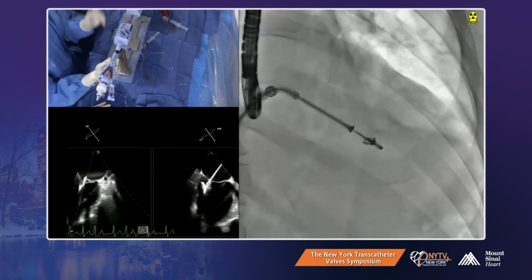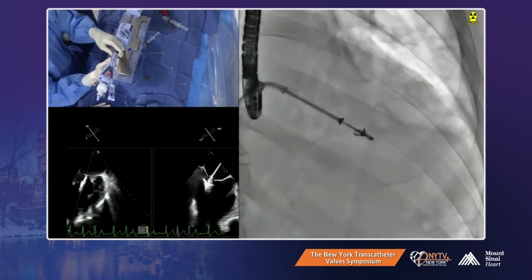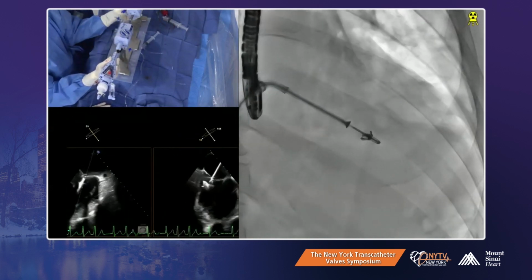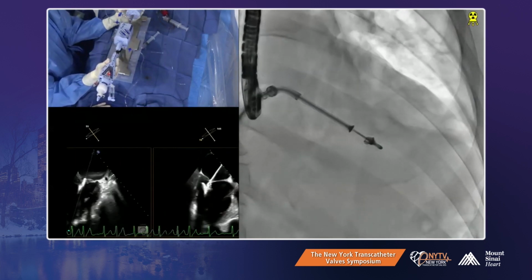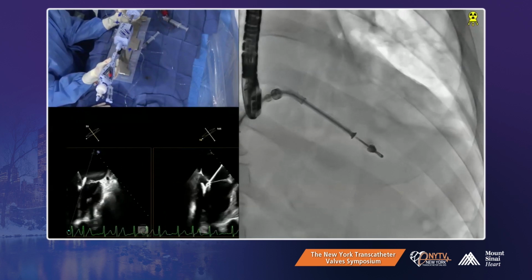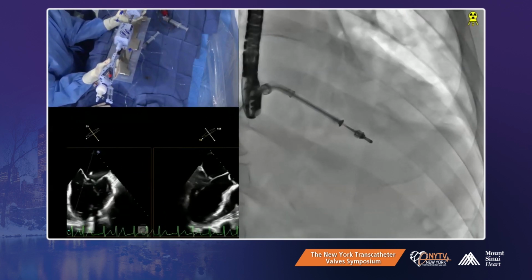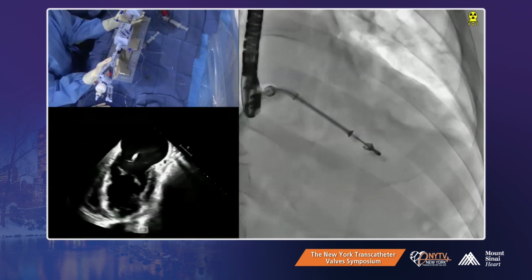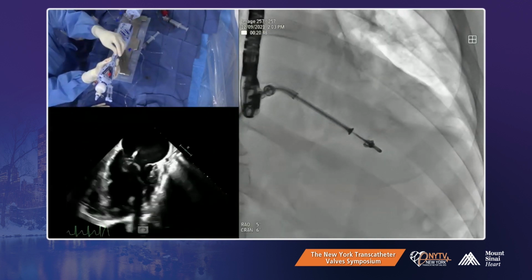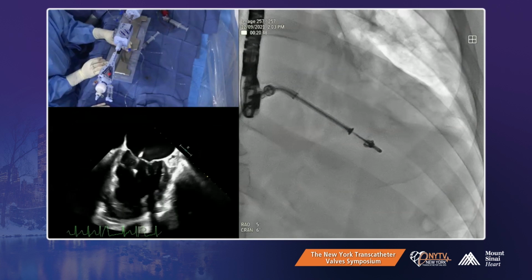Okay. We'll come back once we control the heart rate, I will give you the signal, with more digoxin, more diltiazem. The question is, before we go offline, will anybody think about changing it to XTW now? No. The clip, or do we just try on this? Stick to XT. It's okay.